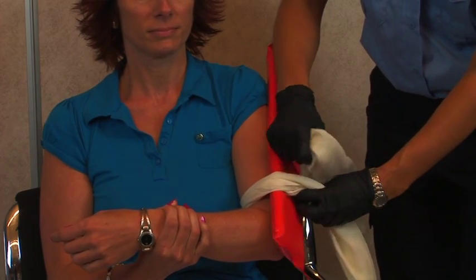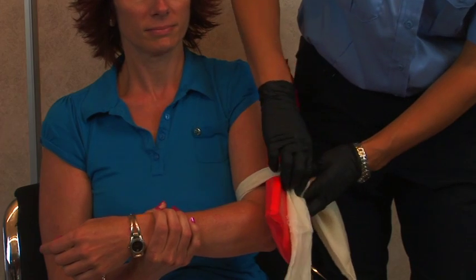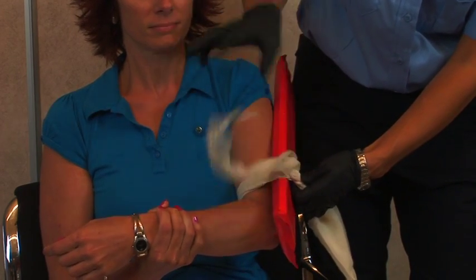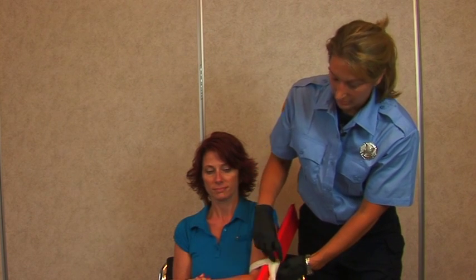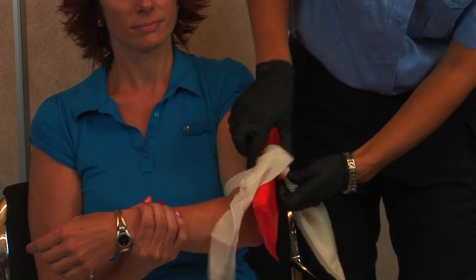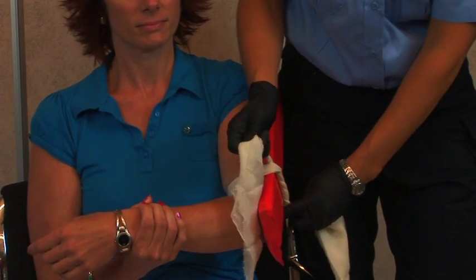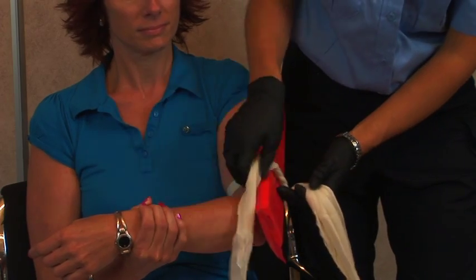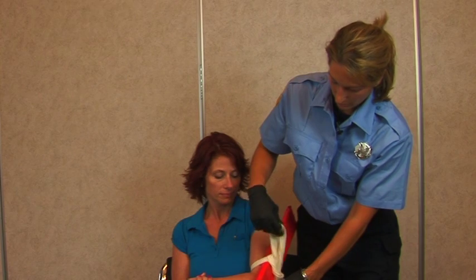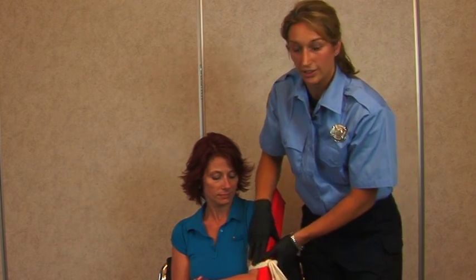This is always better with two people, but if you find yourself alone, you're going to have to make do. When applying the triangular bandage, you can do a simple overhand knot. I like to do it twice because when you pull, it stays in place. Then you can turn that into a square knot, just making sure it's on the rigid side.